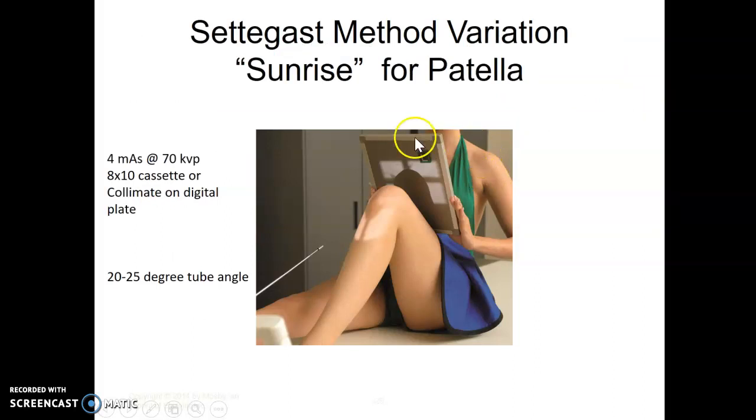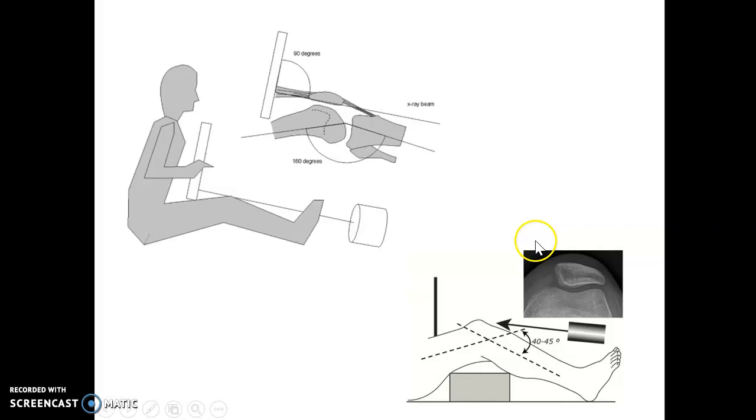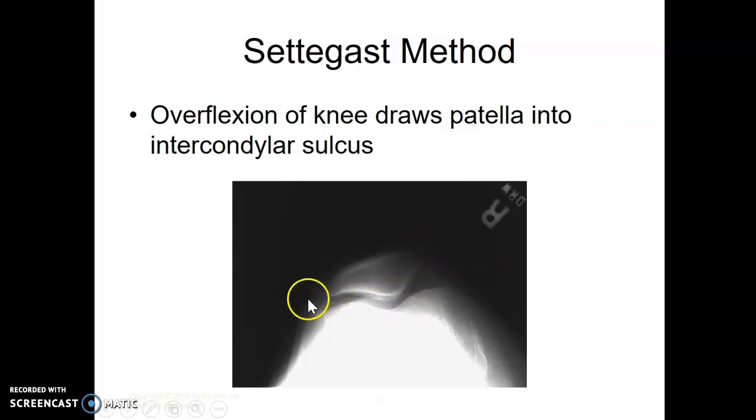Sunrise for patella, this is the one we use most often at our clinical site, where the patient's knee is bent with a tube angle and the cassette is held here. Usually it's an 8x10, or if you're in the digital areas, it's that big cassette, and you'll just collimate in. Looking for kind of an open space here. The patella is going to sit on top. Kind of looks like a sunrise, if you will.